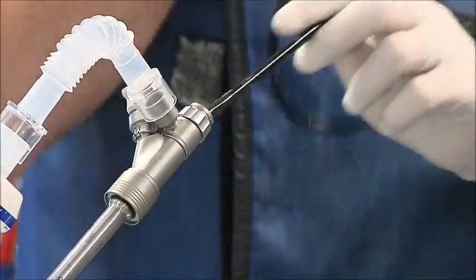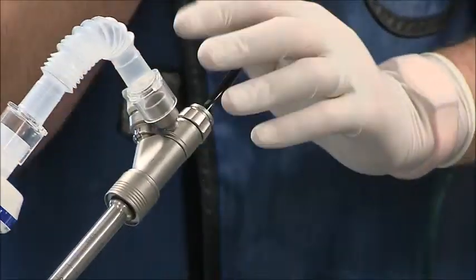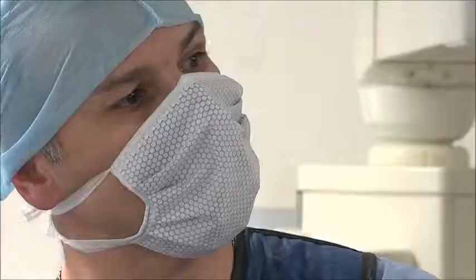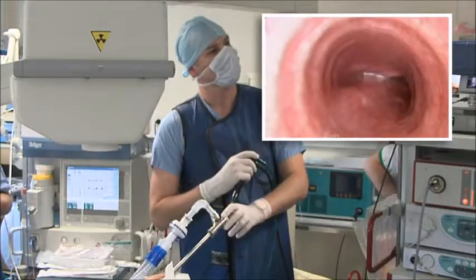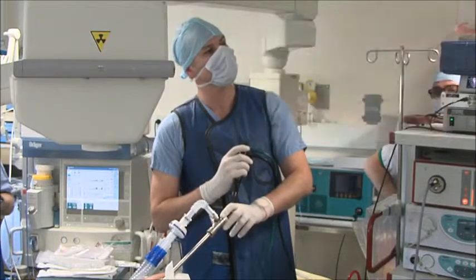For examination and guide wire insertion, we recommend a flexible bronchoscope. Insertion of guide wire, OTW delivery kit, and release of the stent should always be done under radioscopy.